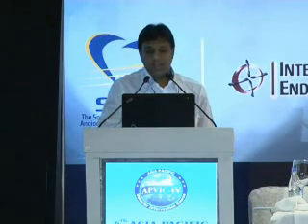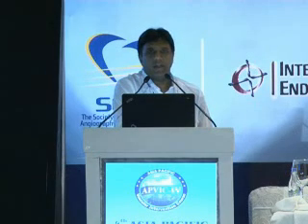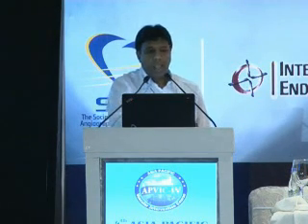These are the drug-eluting stents. The most recent and dramatic advance in stent design is the drug-eluting stent. These stents provide local release of a drug to prevent restenosis. Agents used include the anti-proliferative drugs sirolimus and paclitaxel. FDA approved for use since 2003, they have become popular with substantially lower restenosis rates than bare metal stents. However, they are expensive and the patient must remain on clopidogrel for 6 months after placement to prevent thrombosis.